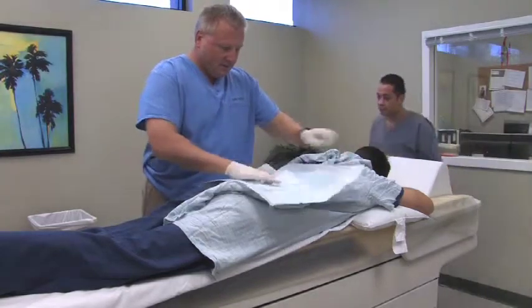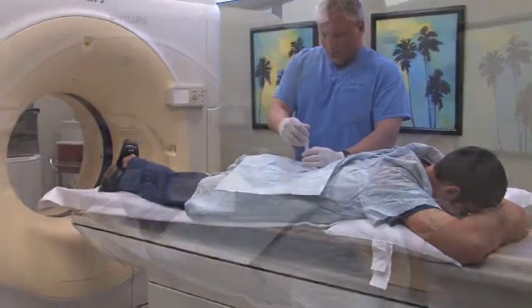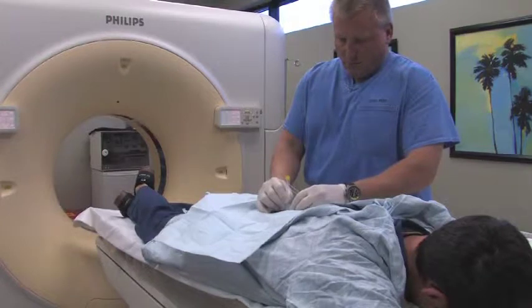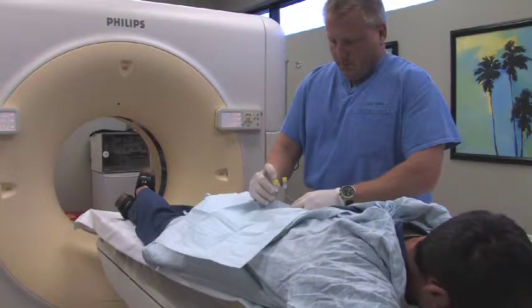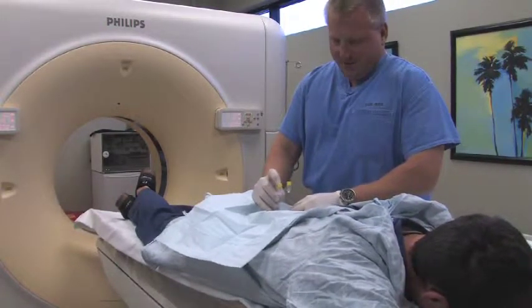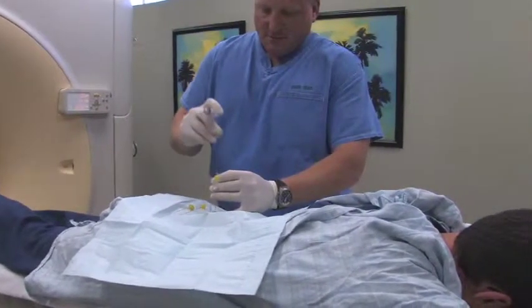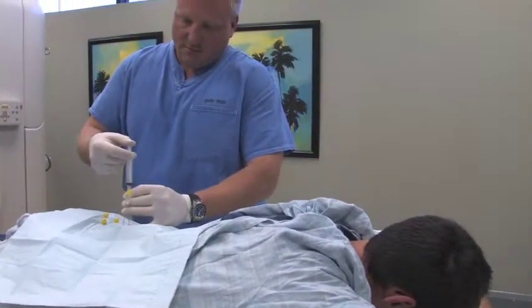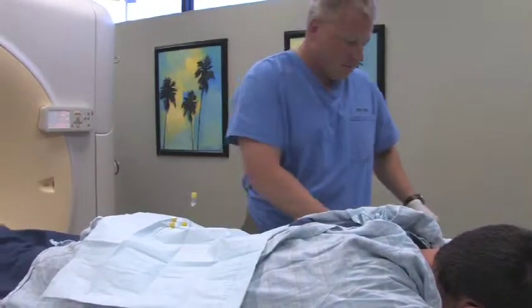The goal of today's therapy will be to actually place a needle from the skin surface, utilizing the CAT scanner to guide us, directly at the opening of that foramen and inject primarily cortisone with a small amount of long-acting Novocaine as well. The goal will be for those two agents to decrease the inflammation on your nerve root itself, getting it back to normal function, but also to serve as a strong anti-inflammatory. Thus, the long-term goal being to get the additional inflammation in the soft tissues out of the area so that nothing else compresses that nerve root to the point where you will get the return of symptoms.